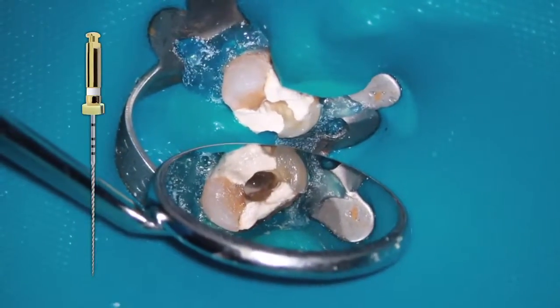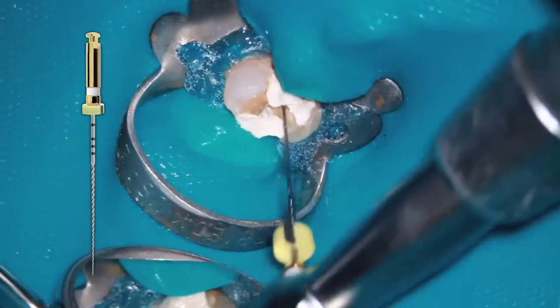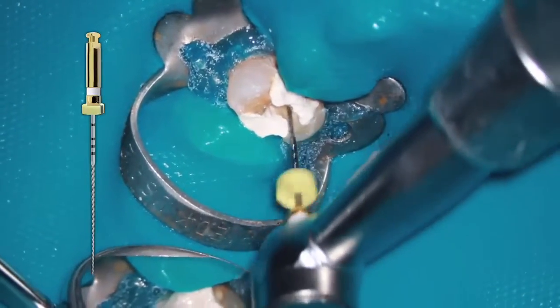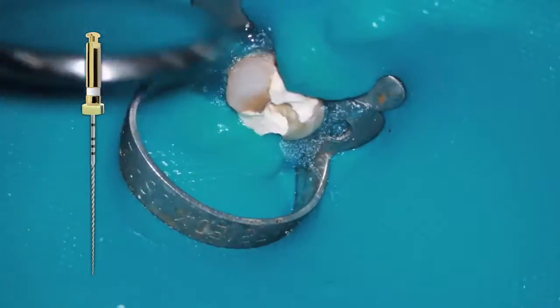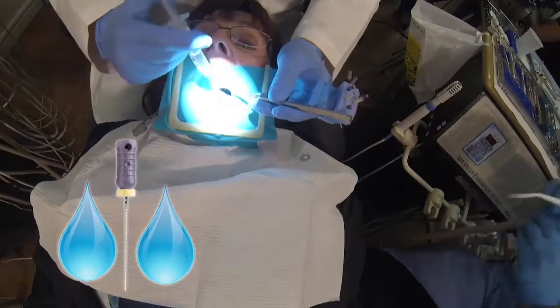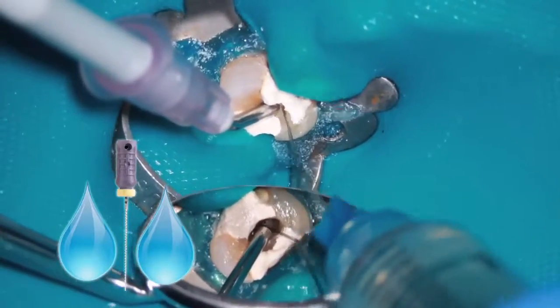Now, I'm going to go down the buccal system the same way, nice and easy, 1, 2, excellent, and there we go. So again, I just want to re-emphasize, do not start your instruments, even your path files, in the canal. Always make sure that you're nice and free before ever starting and before they can advance like that, so that way you don't have any resistance upon starting. And now that we've confirmed our glide path, it's critical that we irrigate, we activate, and confirm our patency.